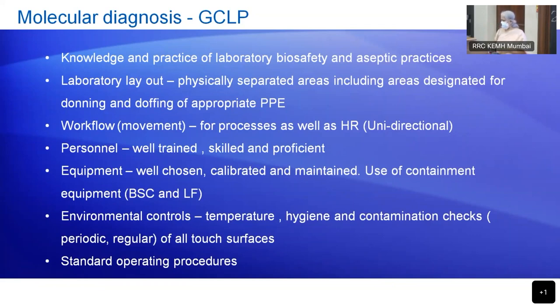And the standard operating procedures should become better. That means document control, standard operating procedures, calibrated equipment, training of personnel, all of that.